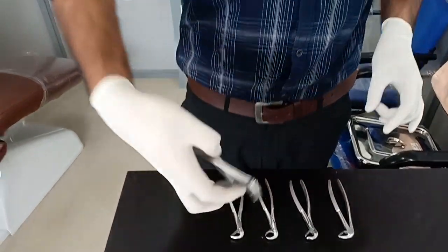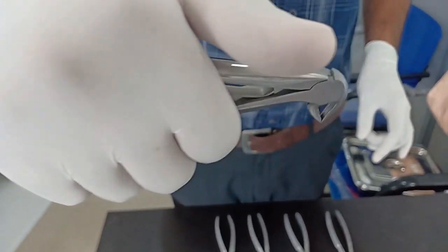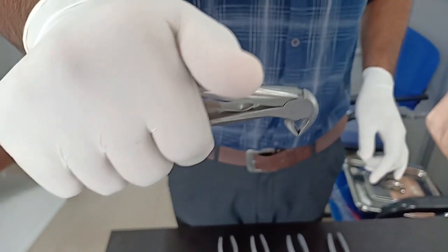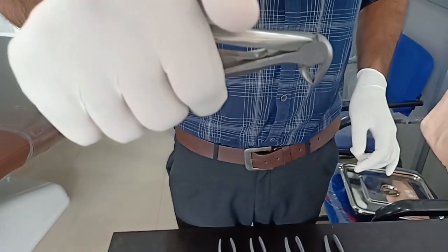This one — as I showed in the last session — is a milk tooth forceps. You can do all the mandibular milk tooth extractions using this instrument.